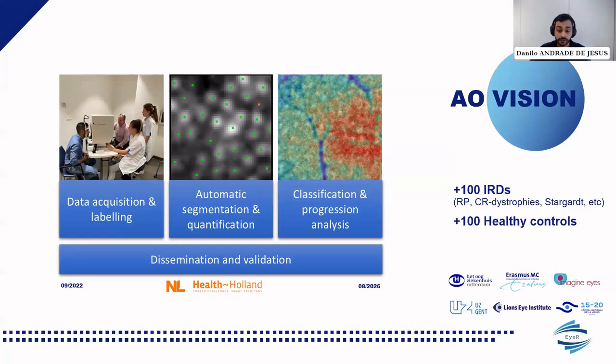This includes, for instance, gene therapy. But to evaluate the efficiency of these new therapies, quantitative and objective methods are needed. Given that the primary cell types affected in IRD patients are photoreceptors, the RTX1 adaptive optics retinal camera offers an excellent opportunity to image these photoreceptors and consequently understand the pathogenesis and progression of IRDs on a microcellular scale.